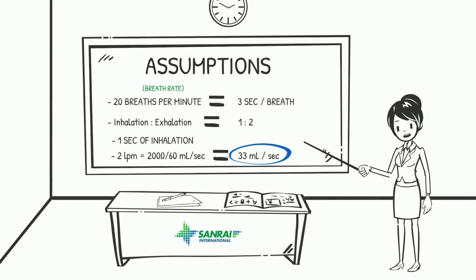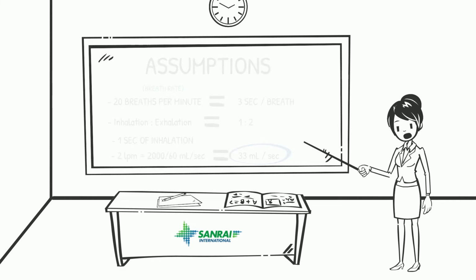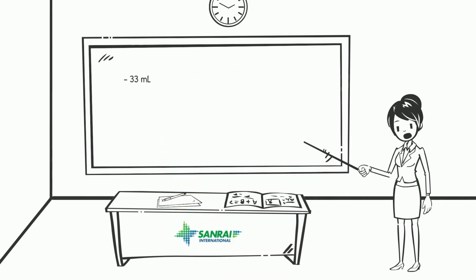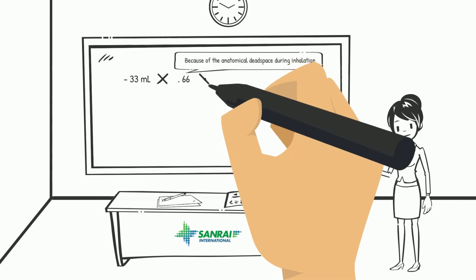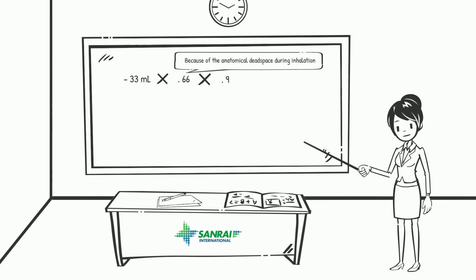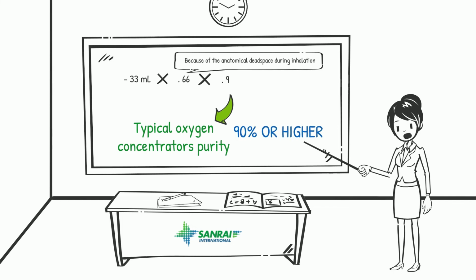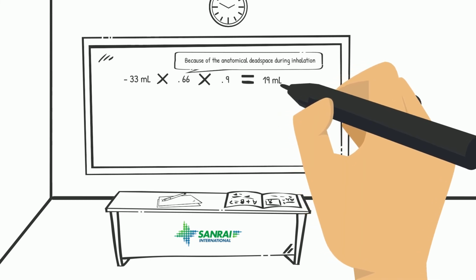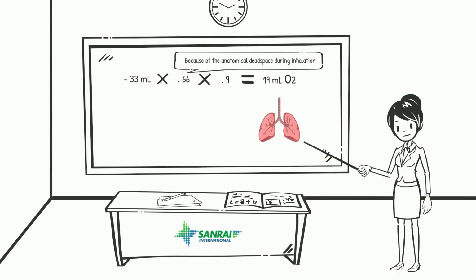Now, if we take this one step further, we are going to take our 33 milliliters and multiply that by 2/3 or 0.66, and then multiply that by 0.9. We use 0.9 because that is a typical oxygen concentrator's purity. So our oxygen purity is about 90%. All of this equals approximately 19 milliliters of oxygen actually entering the lungs.